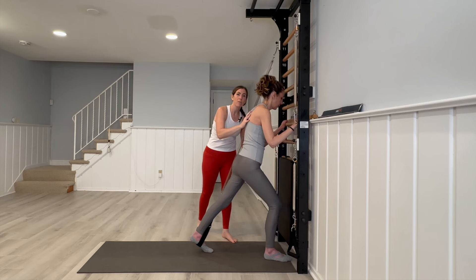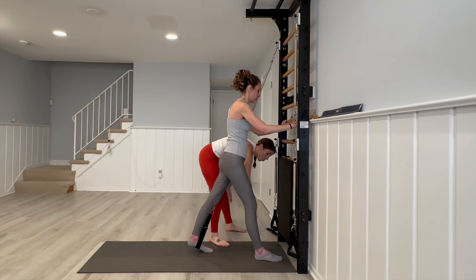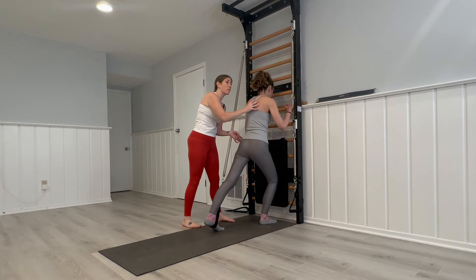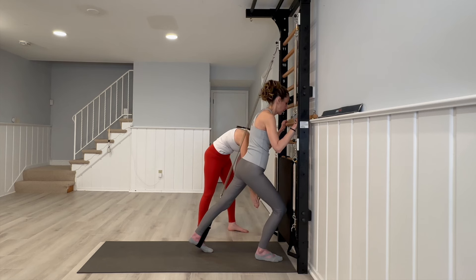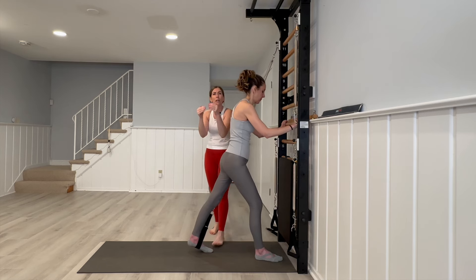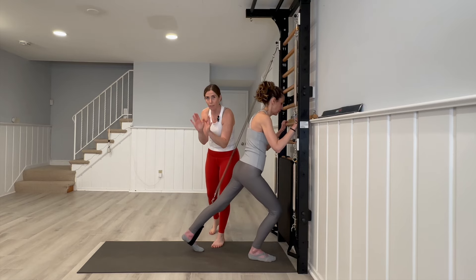Now if that's too easy for the client, we can easily walk that foot back and work the range of motion. We want to make sure that heel is not elevating as they come in. Start the client small and increase the range of motion as they feel comfortable.